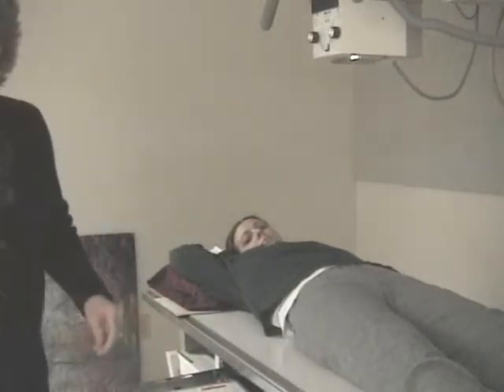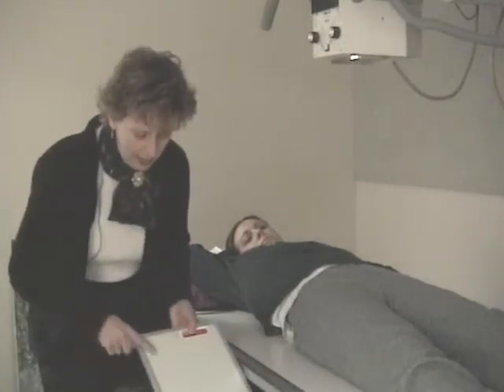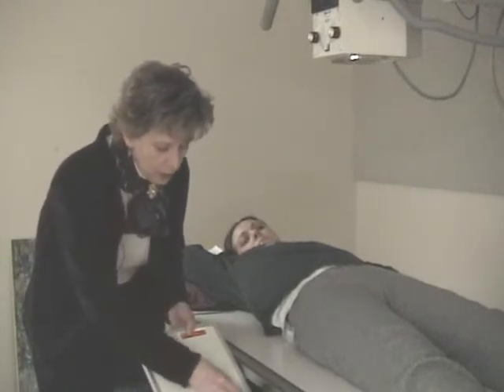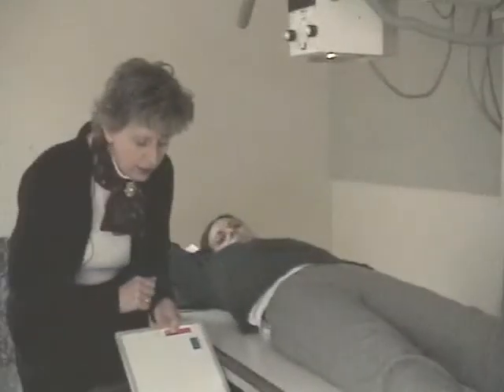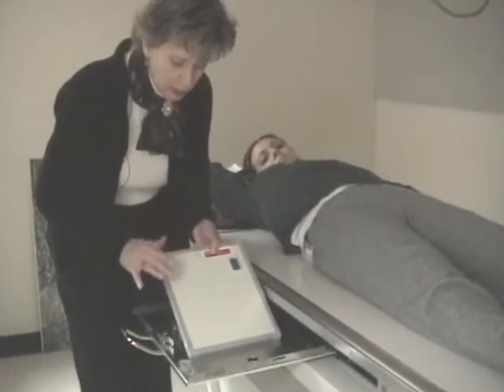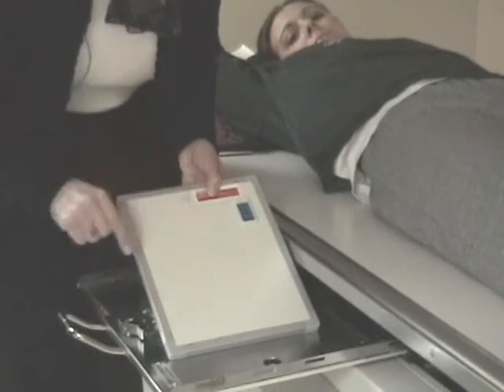Now, the left marker, think about the anatomy again. Here's the acetabulum and the shaft of the femur going that way. Do you think it would be smart to put the L marker down there? I think your better choice would be put it away from anatomy. Acetabulum, head, shaft. This will clear that. The amount of collimation will vary from place to place, from just within film's edge to maybe a 6x6 coned area. You will know how much you collimate. We're going to show about 1 inch all the way around, so I'm happy with that L marker placement there.